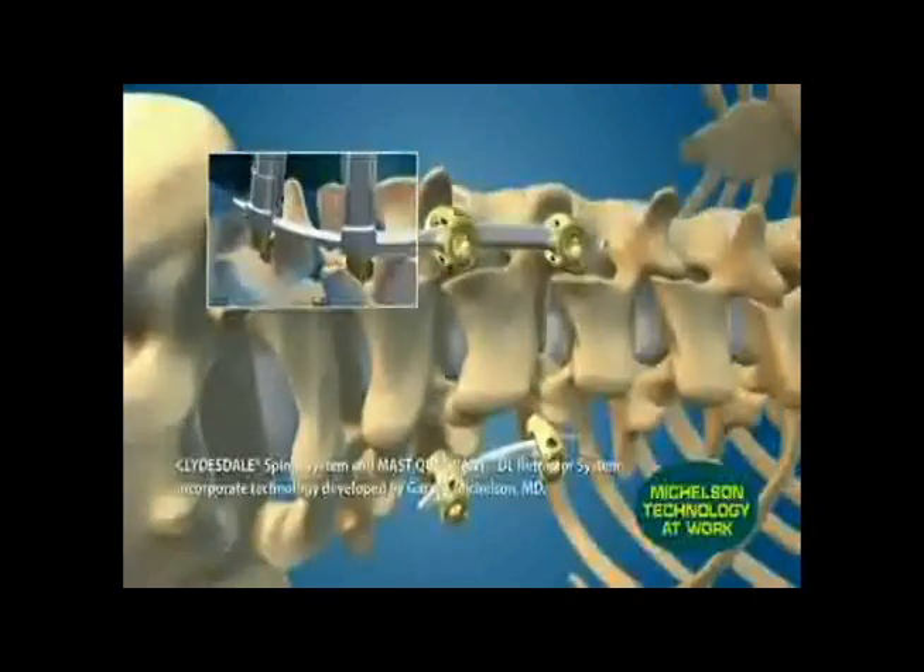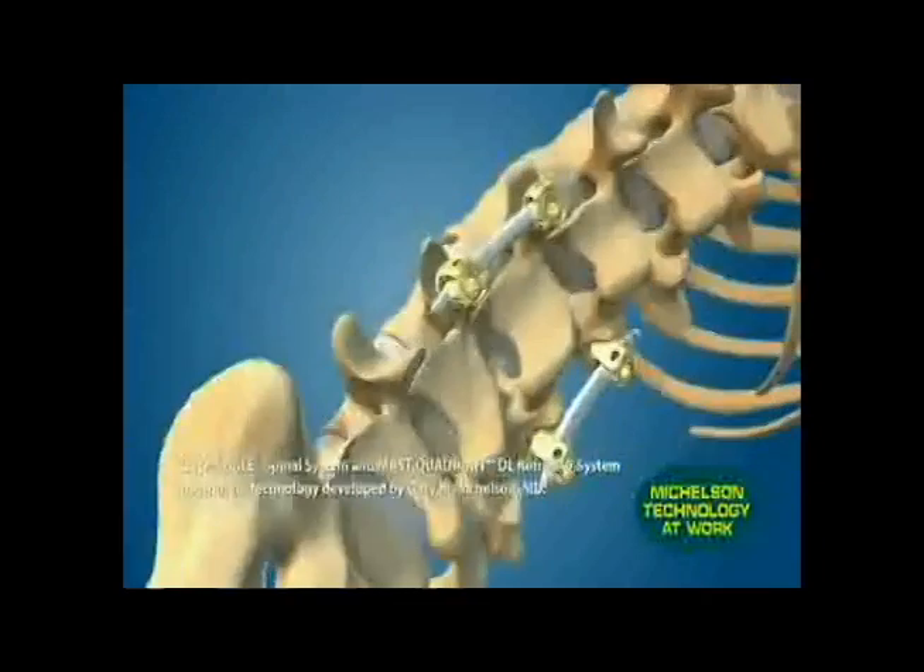Spinal instrumentation can then be added again through a minimally invasive approach, giving a strong construct that will allow quick and early mobilization.